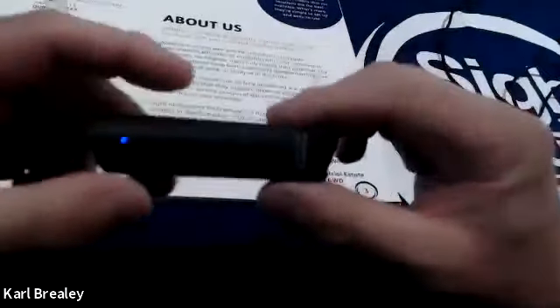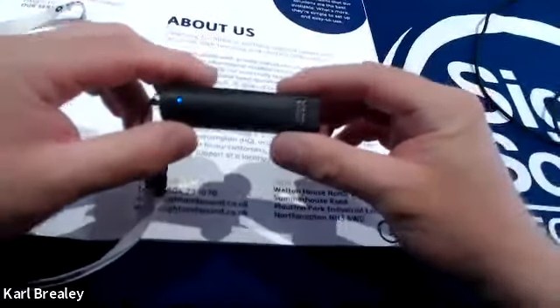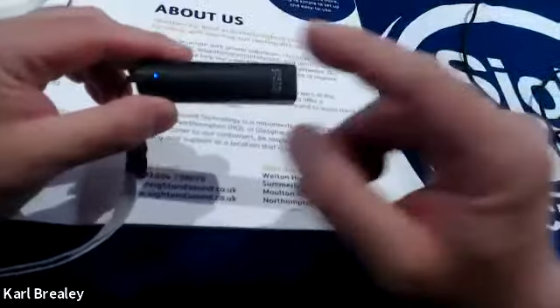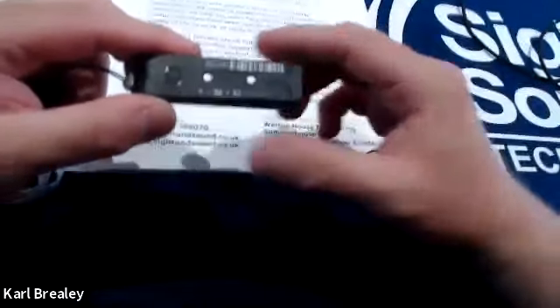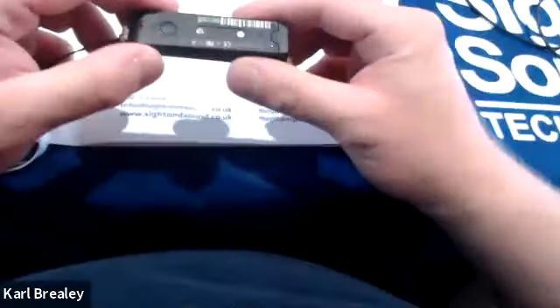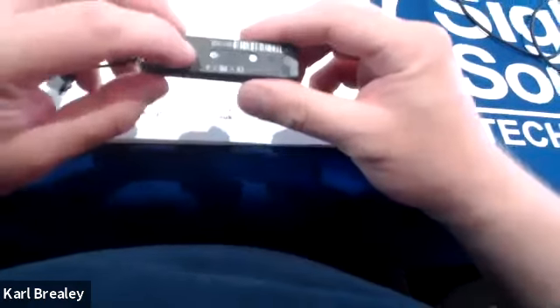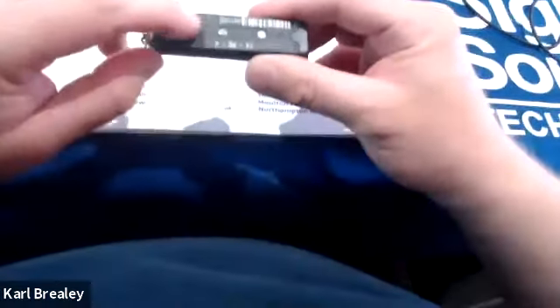But what this device does and what it has with regards to buttons, for those of you that can see the screen at the moment, I will try and get that a little bit clearer. It's just the lighting in here. On the back of the device, we have two magnets and a power button. They're spaced apart. The two magnets are about 1 inch apart, and then just to the back end of the device is a power button. It is quite flush, but with the sense of touch, you can actually feel where it is.